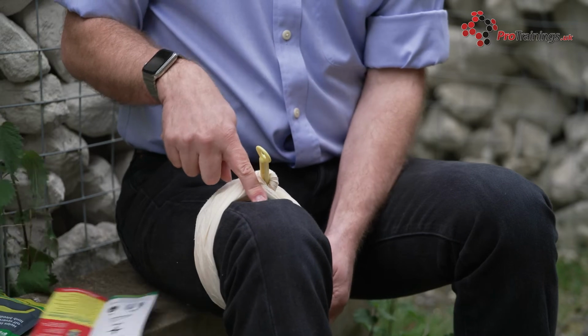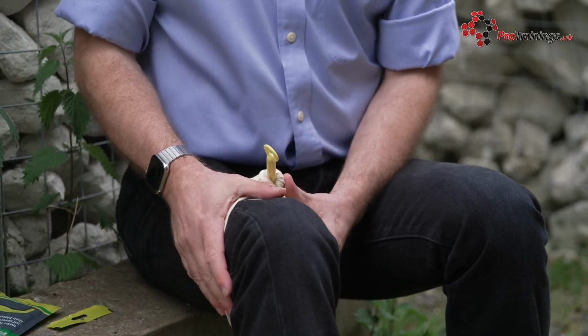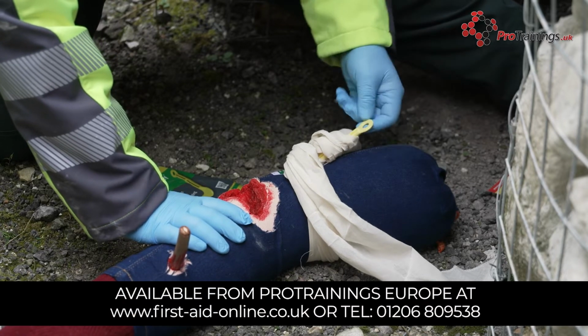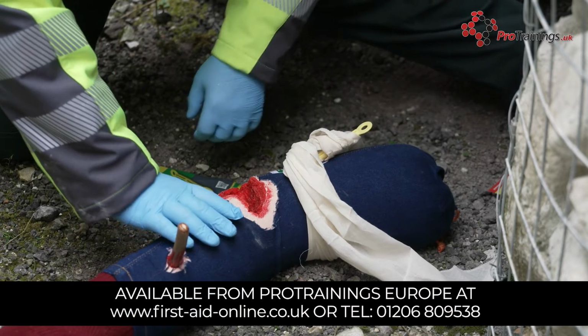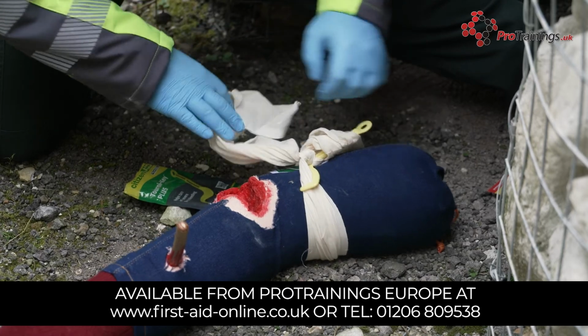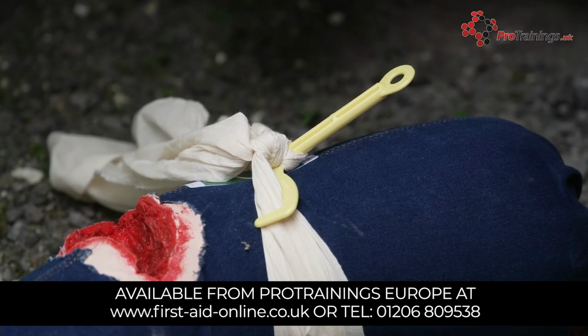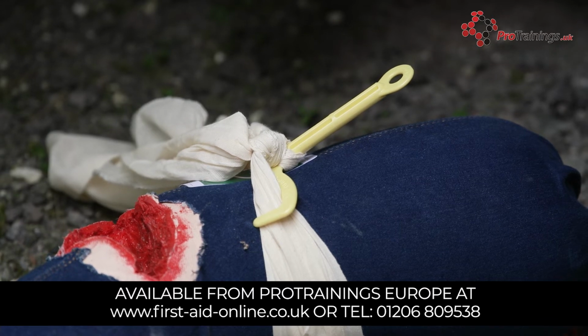Make sure you've written the time on it, and then never take this Tourni-Key off until it gets to emergency services. So you would put these on, but you would never take it off. If you do find blood coming through, you need to tighten it up again. You can do another 180-degree turn and hook it back in place on the other side, and that will apply more pressure and stop the bleed.